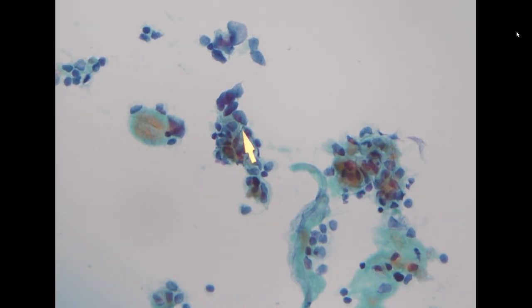However, in other area, you can appreciate the cell has increased NC ratio. The shape of the nucleus looks like what we call OAT. In the old time, small cell carcinoma has been called OAT cell carcinoma. It has an OAT shape and with molding, cellular molding. Okay, so in this area, this looks more like a small cell carcinoma. So the case we've seen last week is a case with small cell transdifferentiation.